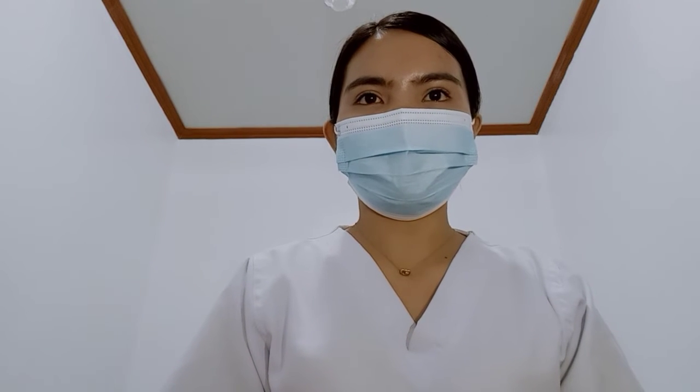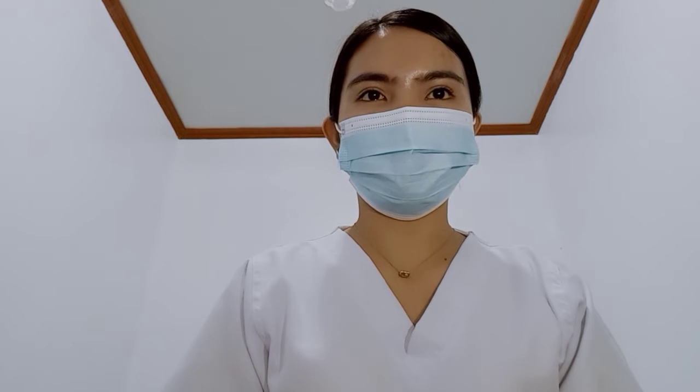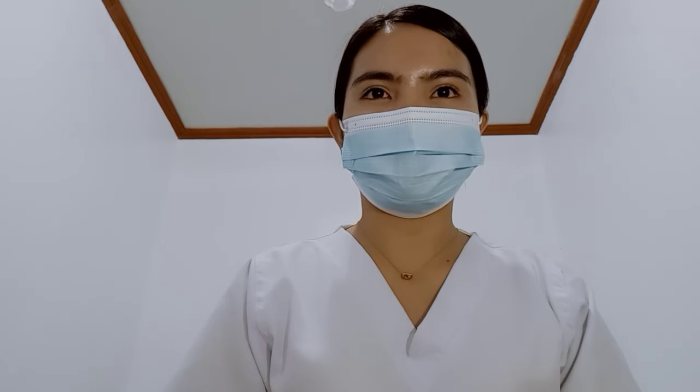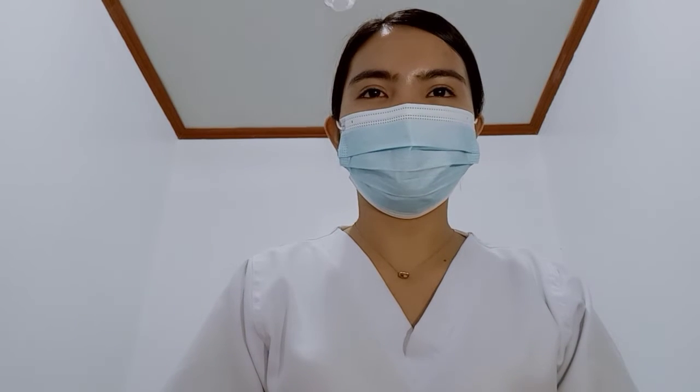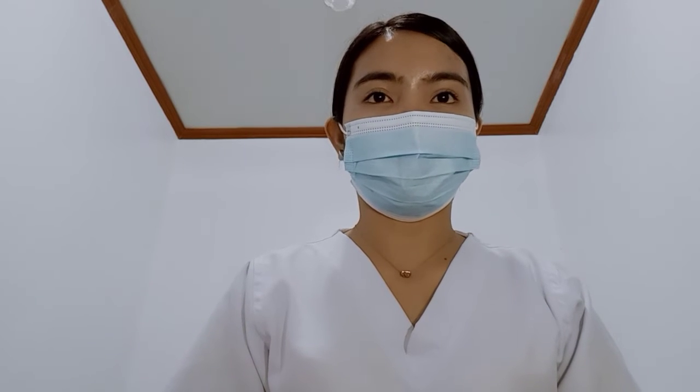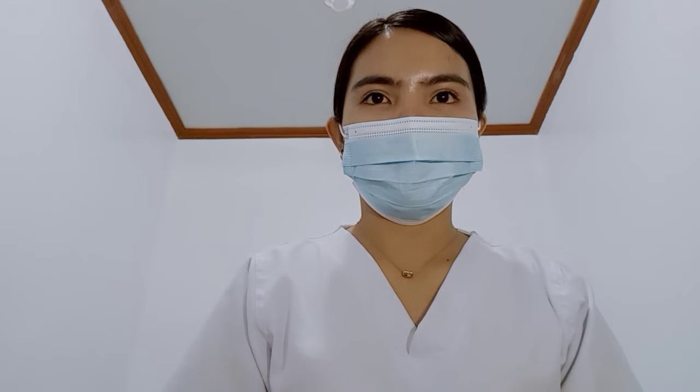Second is a stethoscope, sphygmomanometer with appropriate cuff size, watch with second hand, pulse oximeter, swab or cotton ball soaked with alcohol, sponge towel, paper bag, record or form sheet, ballpoint pen in black, blue, and red, a tray to set all equipment needed, and lastly, toilet paper.